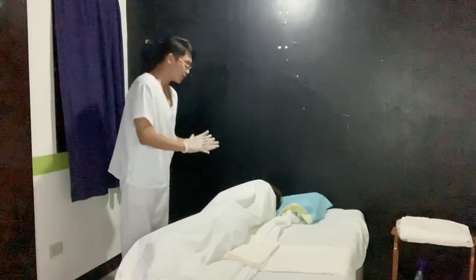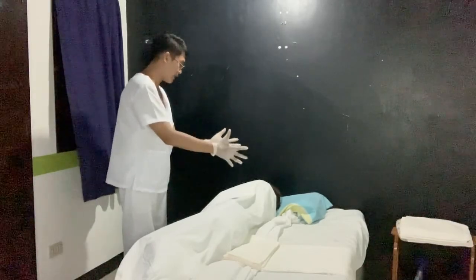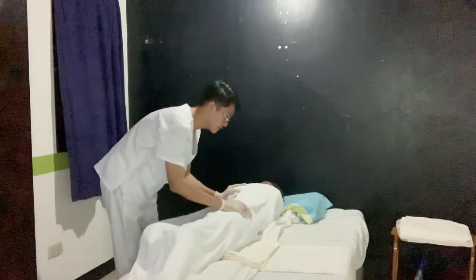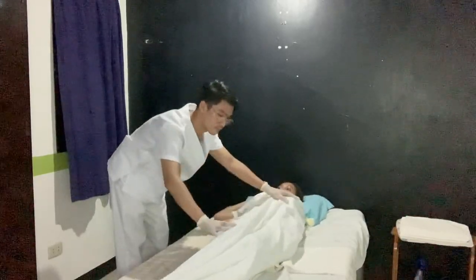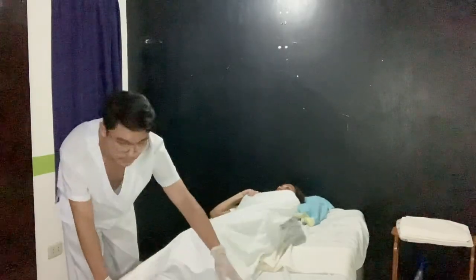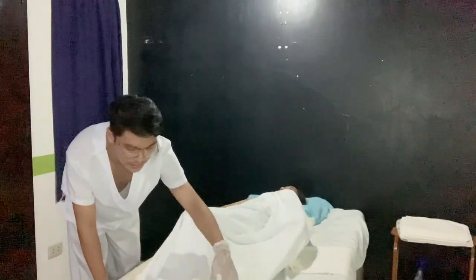So ma'am, I will now move you from the center of the bed again. Okay, on my count of 3. 1, 2. Okay, make sure to always provide privacy for the patient.